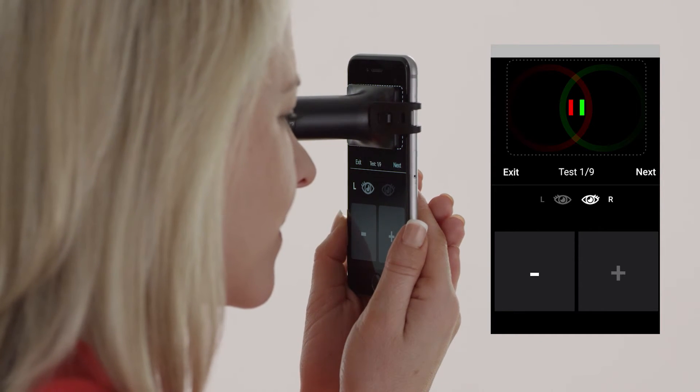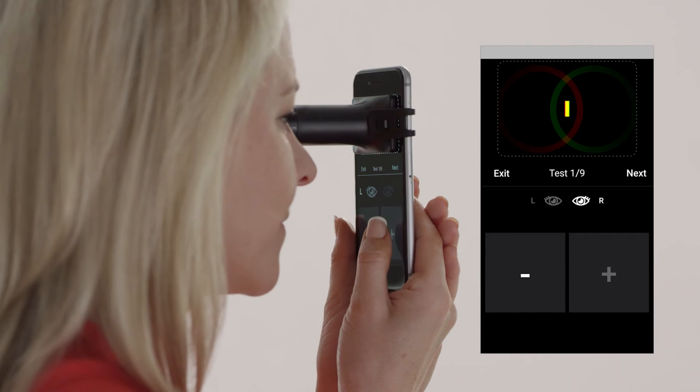If at any point you only see one red or one green line, try readjusting your position very slightly. If your eyes have common refractive errors such as nearsightedness or farsightedness, it's perfectly normal for these lines to appear blurry. Once you're satisfied that the test lines are accurately fully overlapped, you can proceed.